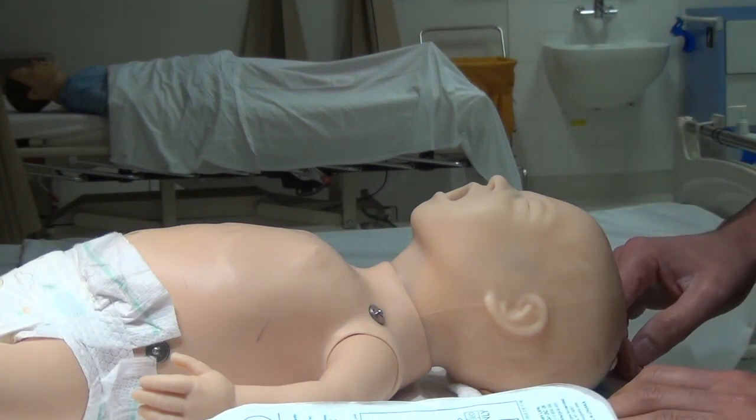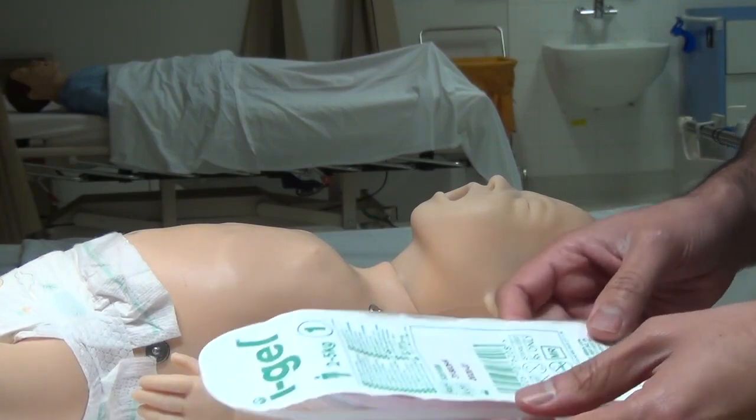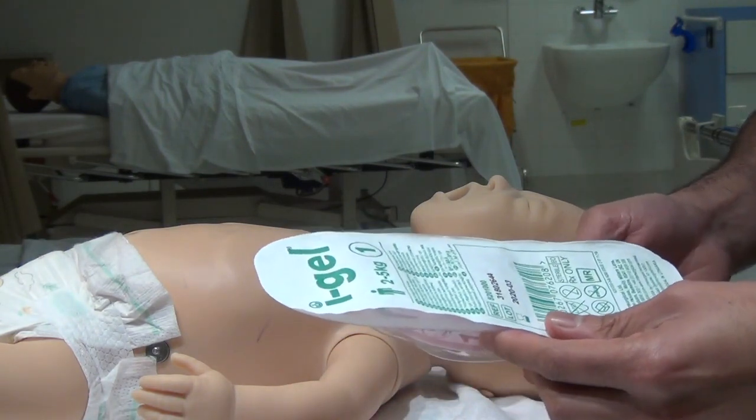Laryngeal mask airway is used when mask ventilation using a self-inflating resus bag or T-piece is ineffective. It's an alternative to an endotracheal tube.